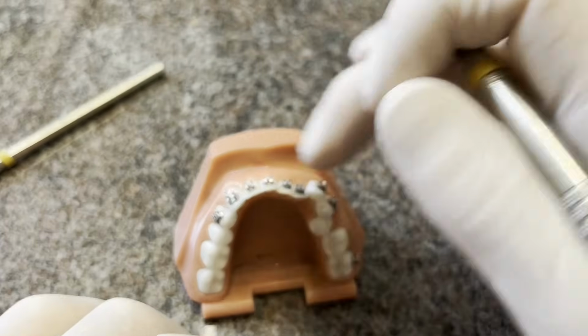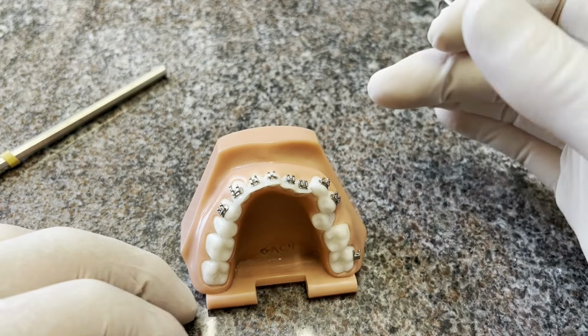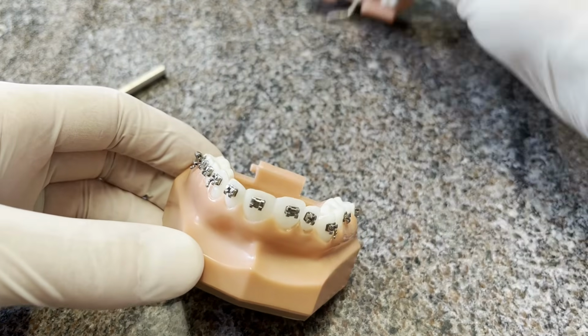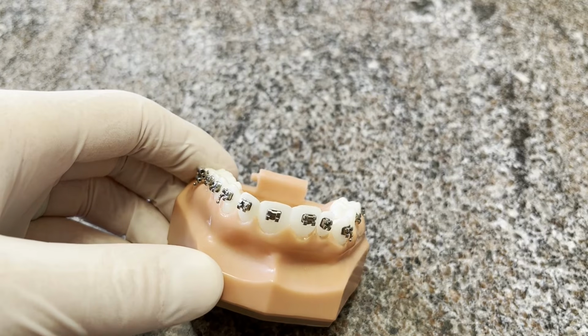So then you get those positioned 3 to 3. The doctor will come and perfect the position as best they're able, and then cure it into place. The uppers are very similar, except now the patient's bottom jaw has fallen off, so we'll just set that aside. Hopefully they don't forget it like they do their coat oftentimes.